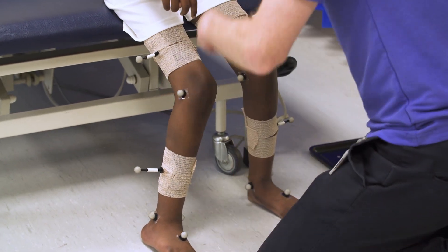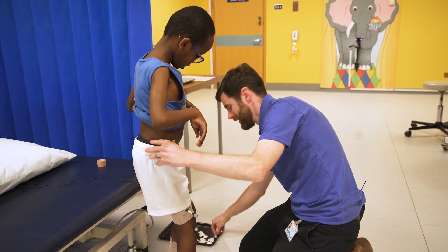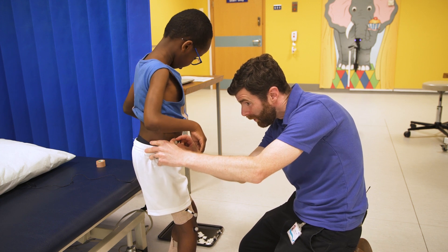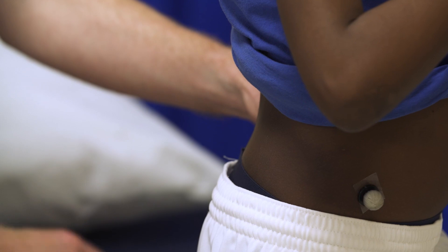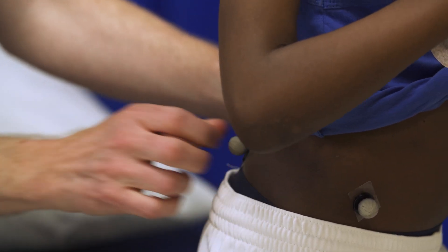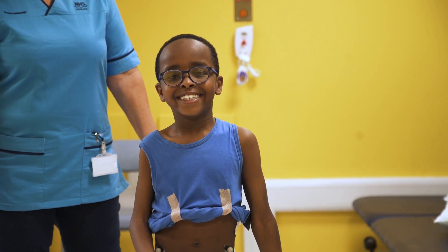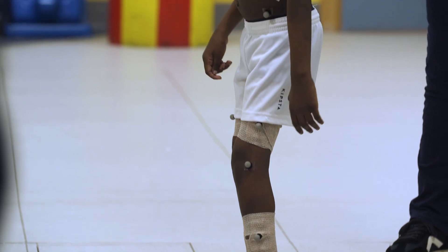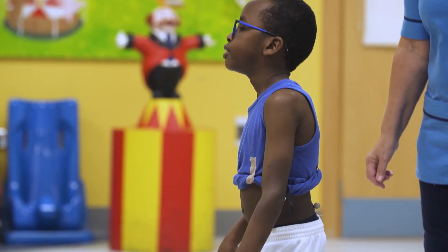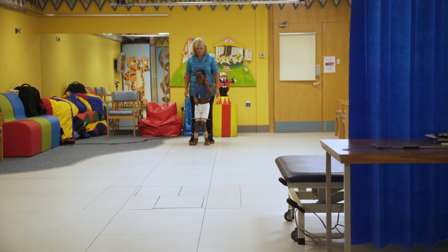You're doing a really great job and we're nearly done. One at each side on the front and then one at each side on the back. Okay, so now that's got all the markers on. You can do it at your own speed, and if you need rests you can have rests, and if you needed any help from your walker you could use that too.